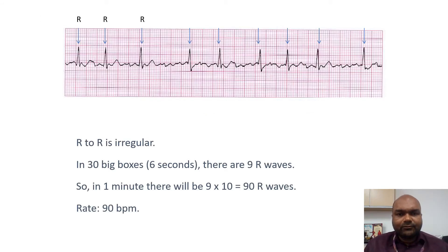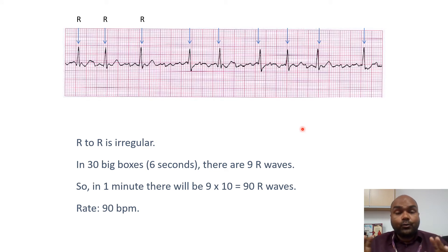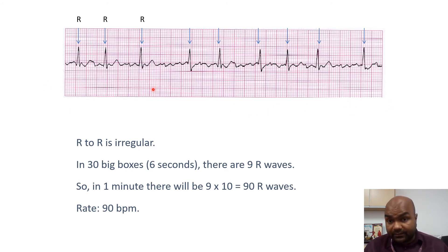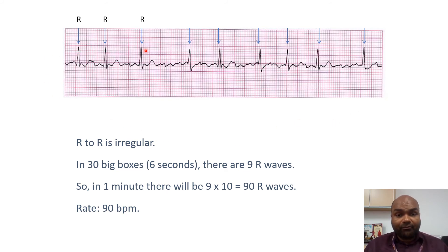If the R-R interval is irregular, as in this ECG, how do we calculate the rate? Very simple. One big box is 0.2 seconds and five big boxes is one second. In this strip, we choose 30 big boxes, which corresponds with 6 seconds. This whole strip here — 30 big boxes — is 6 seconds. Then you calculate the number of R waves present in those 6 seconds of the ECG strip.